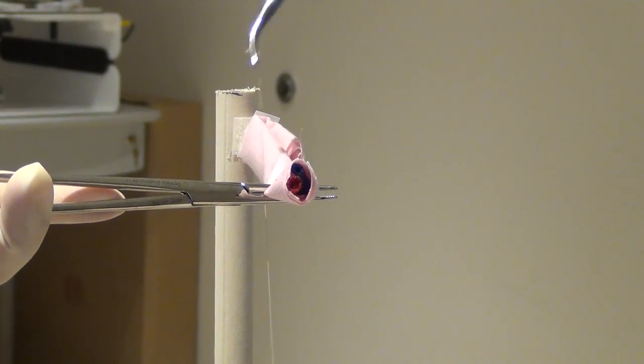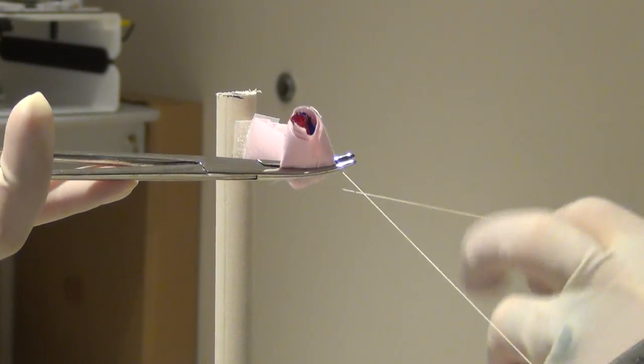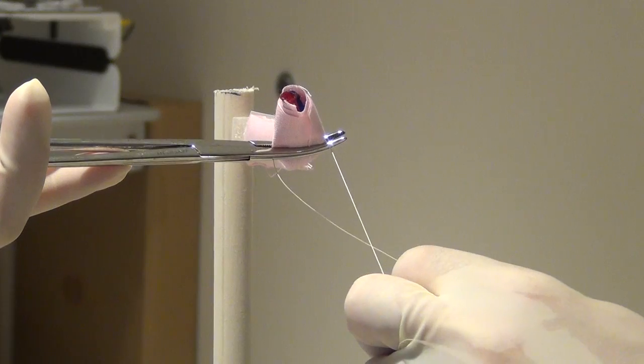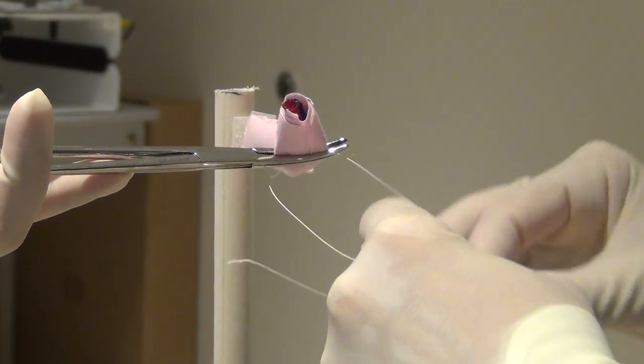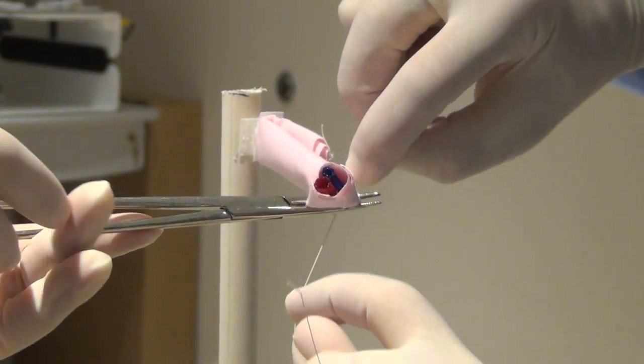Here the clamp holding the suture is passed from one surgeon's hand to the other. The suture is then brought around the tip of the clamp holding the pedicle. A knot is tied and it is securely placed down on the pedicle, and then the clamp is removed.